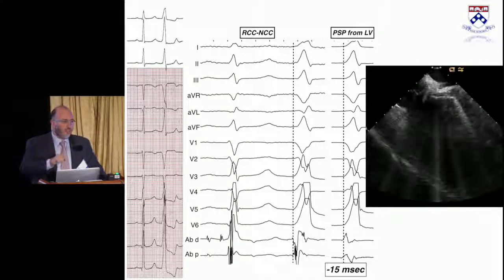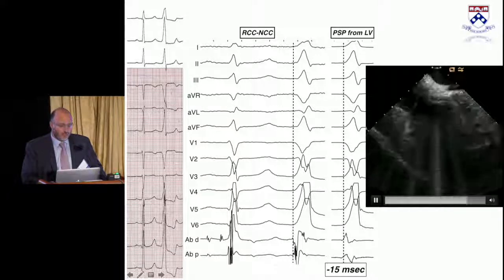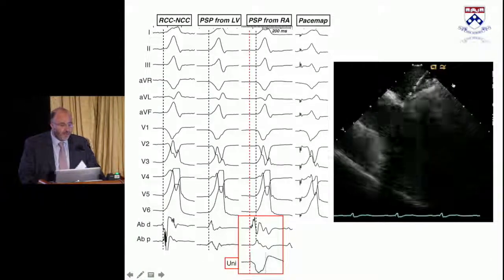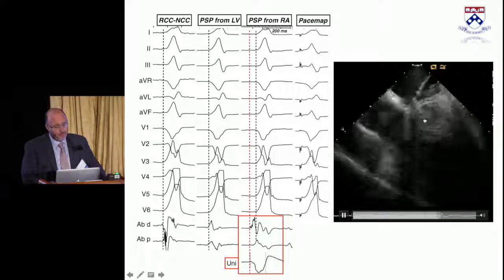And just the concept that I explained before is what are your neighbors, what are the neighbor structures to ablate this area. We saw in intracardiac echo a neighbor structure, but it didn't make sense, right? That's the right atrium. Well, we just put the catheter there, followed on intracardiac echo, and placed it right opposite where we had ablated.